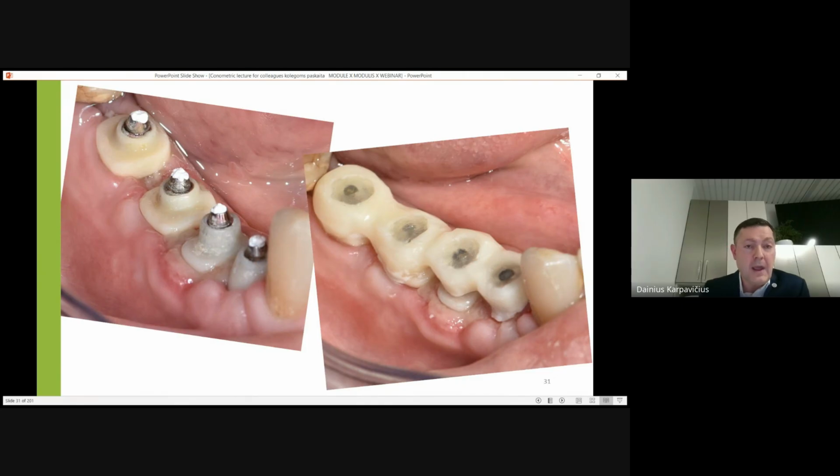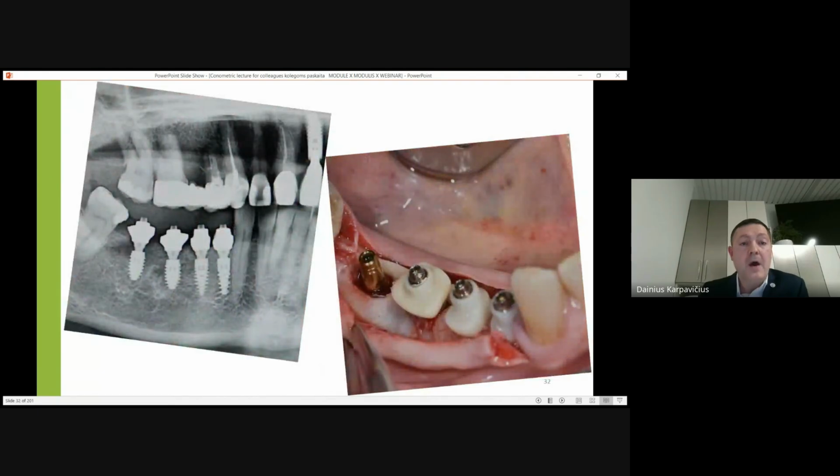So it's the doctor's solution, the doctor's decision. But I like to do splints. I'm very safe with this. It takes about 10-15 minutes, and for these couple of months, my implants are protected. Now, after the healing period, sorry, this is not after the healing period. This is the slide that I wanted to show you, more or less what we are creating.